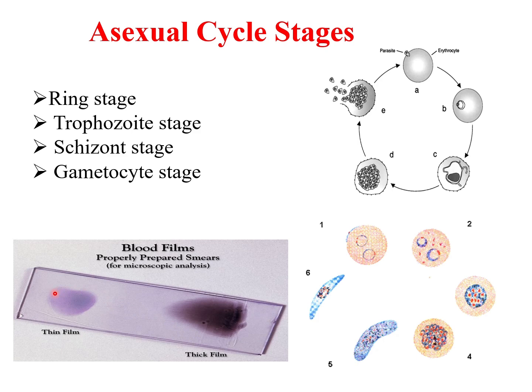Now, I would like to remind you about two notions: the difference between a thin and a thick blood film. So basically the thin film is a drop, and this allows us to detect the parasite in case of heavy infections, where just a drop will allow us to see the required stages.